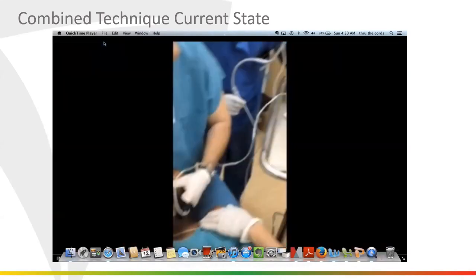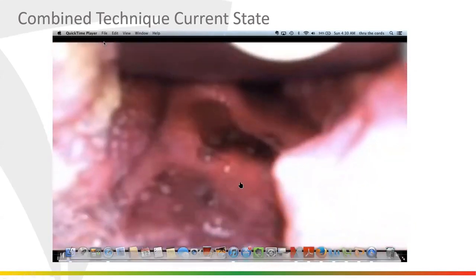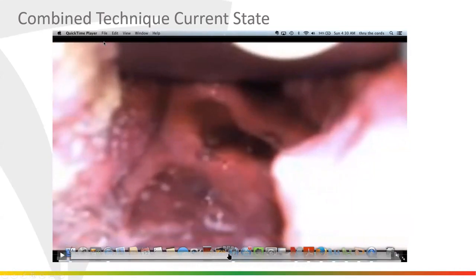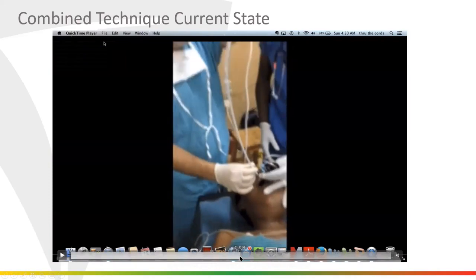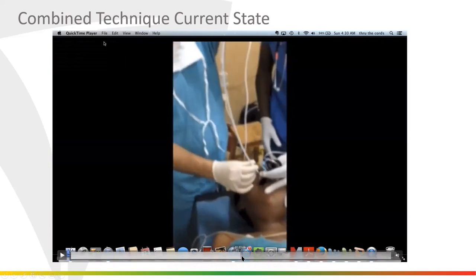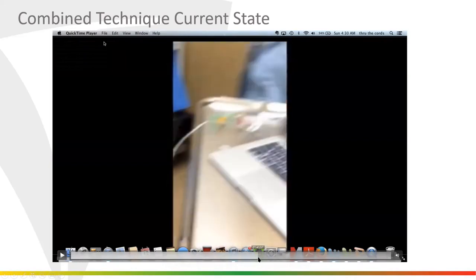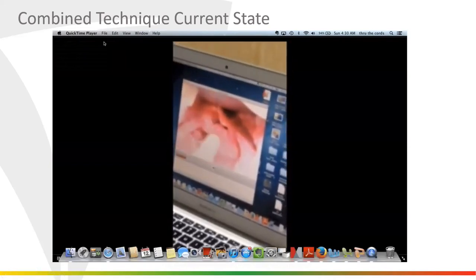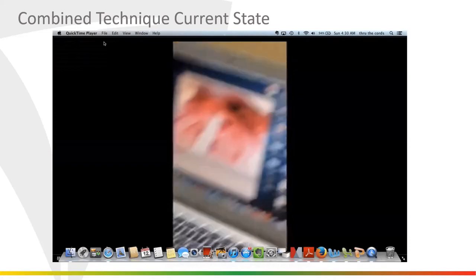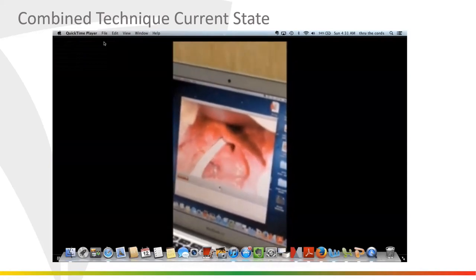And so we were able to put her to sleep. The video laryngoscope goes in, we go around the tumor, and we can now see where we want to be. You can see everything's distorted and crowded. Then an Ambu scope, or a fiber optic scope, not hooked to anything, because again, we didn't have monitors in Rwanda either. Lots of donations, but not complete sets. And once it arrives in the view of the video laryngoscope, it's now a dynamic stylet, and now you have maneuverability, and everything looks very different.